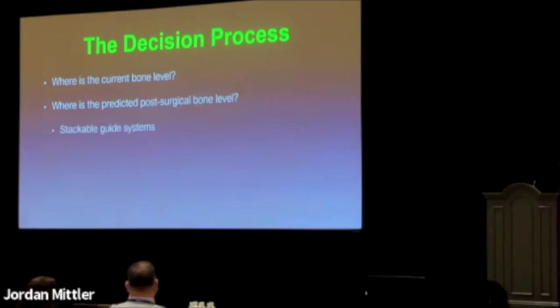Just briefly allude to the stackable guides we have at Sequence and some others here. These stackable guides allow you to do some of these things, but what I found is, and you just mentioned comprehensive surgery, I find stackable guides serve a purpose. I think they really help general dentists restoring more than they help the surgeon doing the surgery. I think a lot of surgeons don't really like the stackable guide system, but they do it because it enables their GP or someone else to restore it a little bit easier.